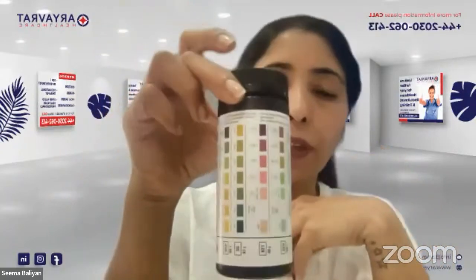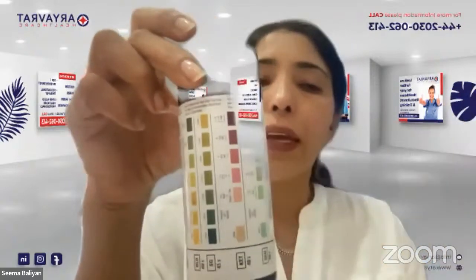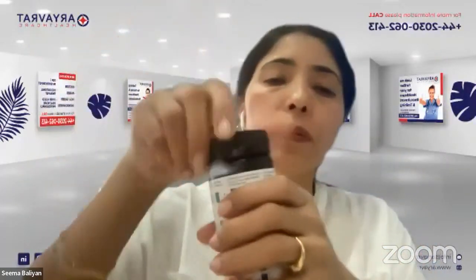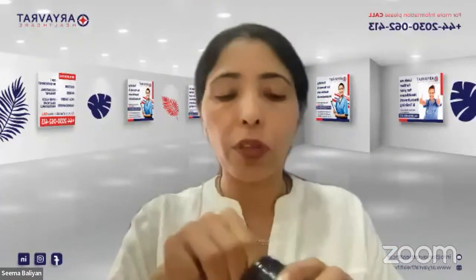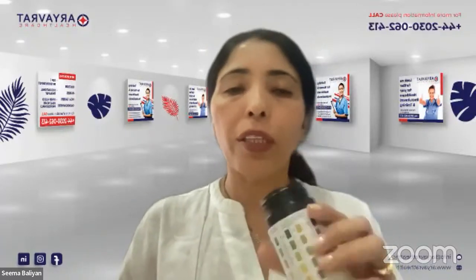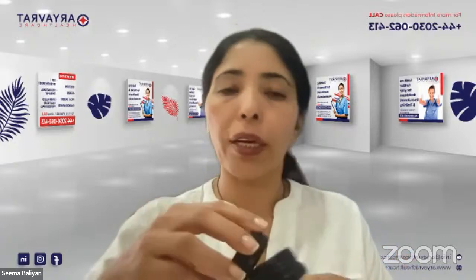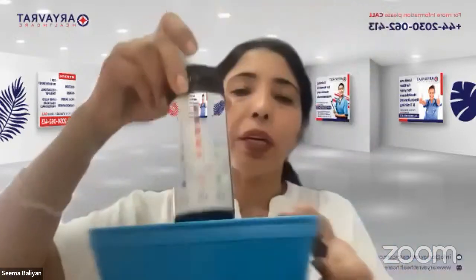So the first thing that we will put in our tray is going to be the bottle of strips. Like everything, we are going to check that it is intact and within expiry. After that, we are going to open the bottle, and we will also check inside to see that all of the strips are facing the right way up. Once we know that all of them are facing the right way up, we are then going to say that it is fine for me to use, and then you are going to be putting it into your tray.